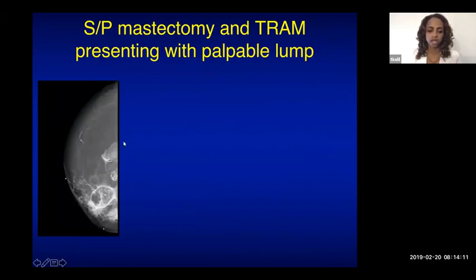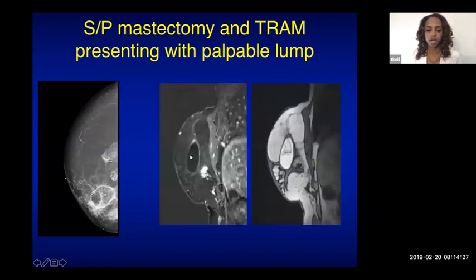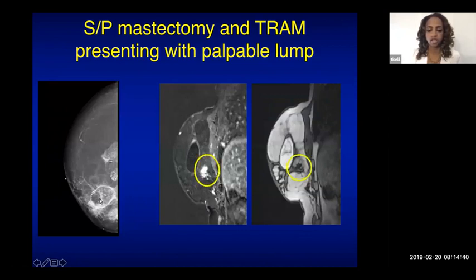In a patient with mastectomy and tram flap reconstruction presenting with a palpable lump, MRI distinguished fat necrosis — following fat signal on T1 non-fat suppressed images — from an additional enhancing spiculated mass that was suspicious, biopsied, and confirmed as recurrent invasive ductal carcinoma.